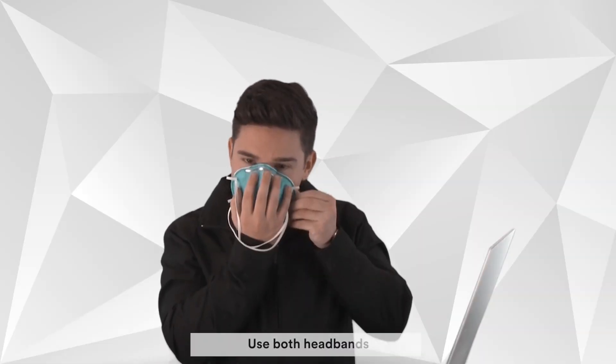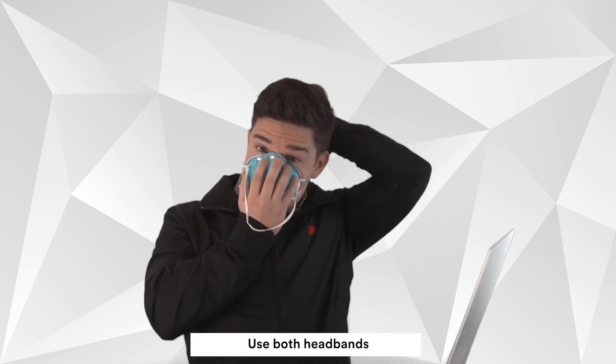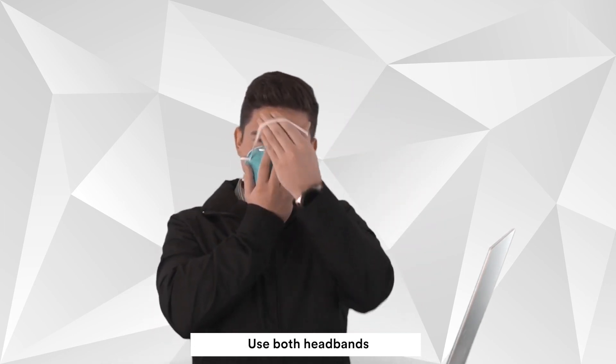Users must be clean-shaven. For example, men cannot have stubble or a beard. Be sure to use both headbands, one towards the top of your head and one around the back of your neck.